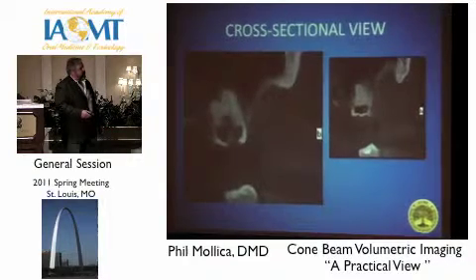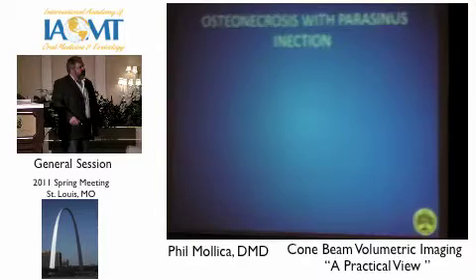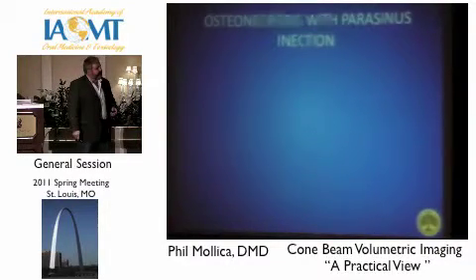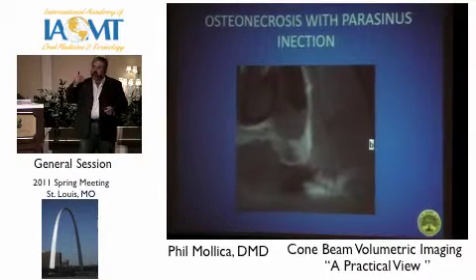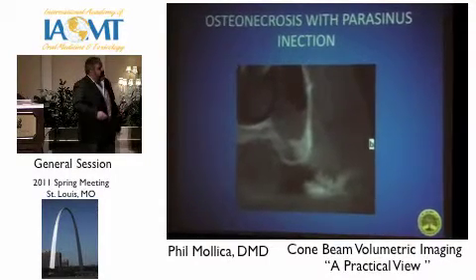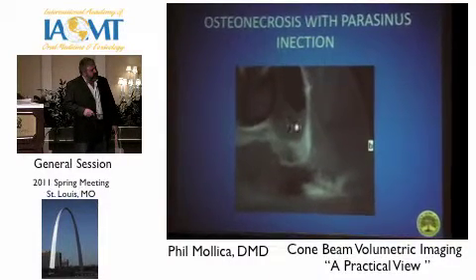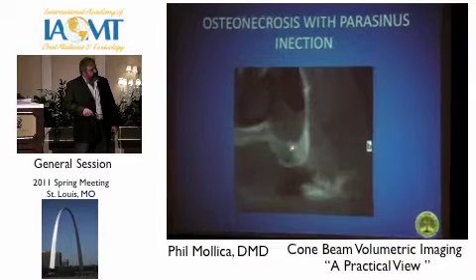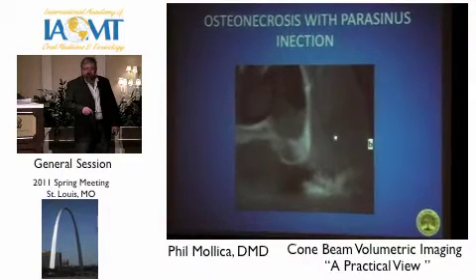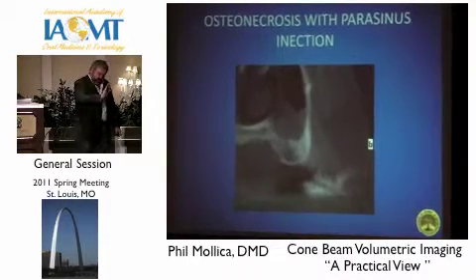So what I want to do now is, let's take a little tour of what this tooth is producing here. We'll take an osteonecrosis, parasinus infection. Working mesially, right off the distal of the first bicuspid, let's work our way back through the tooth. Here's the maxillary sinus. Here's the turbinates. Now, this whole area should be clear. We're talking about an infection, a low-grade constant infection in here, affecting the sinuses. This is self-perpetuating itself. So we're moving, once again, mesially, and we're working our way distally.